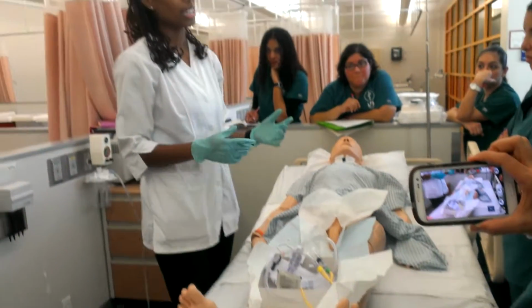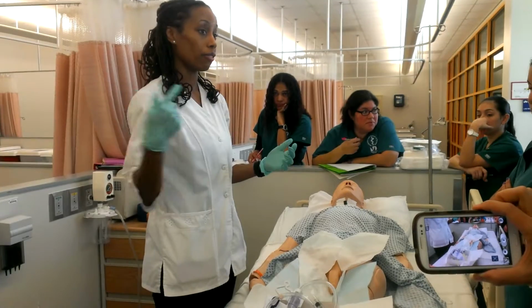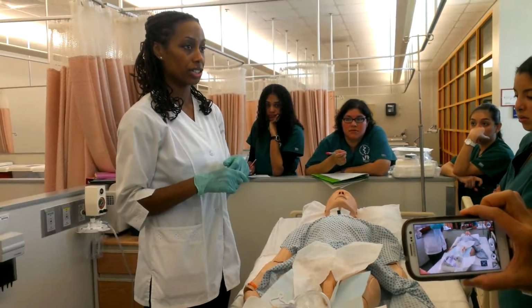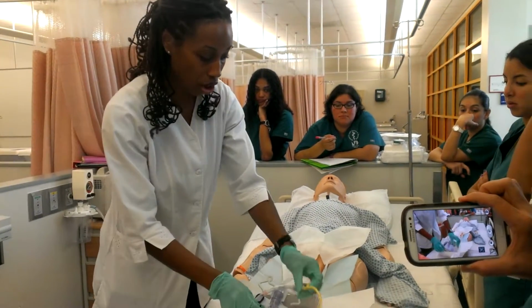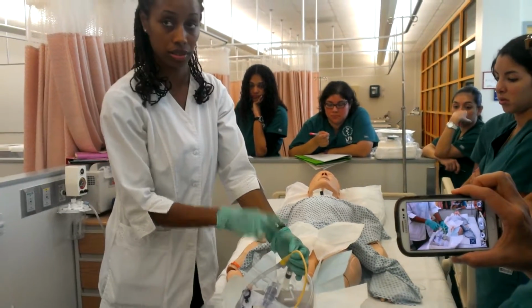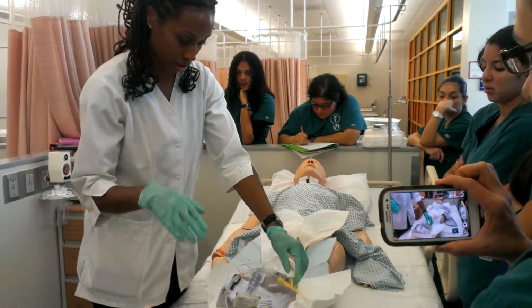For the men, yeah, they definitely feel the burning because you're going in a lot further. On women, you're going 3 to 4 inches. On men, you're going 7 to 9 inches. You're going all the way to this Y, and you don't stop. Even if you see urine, you go all the way.